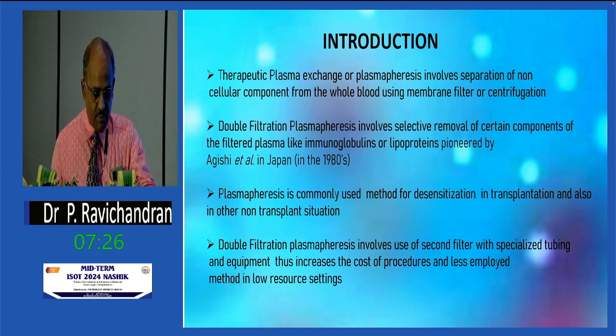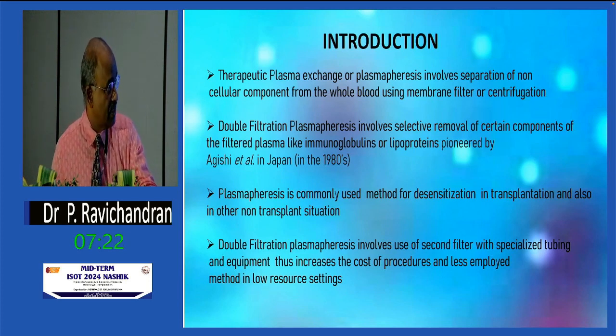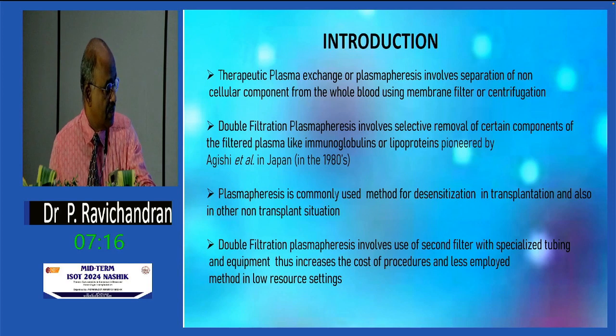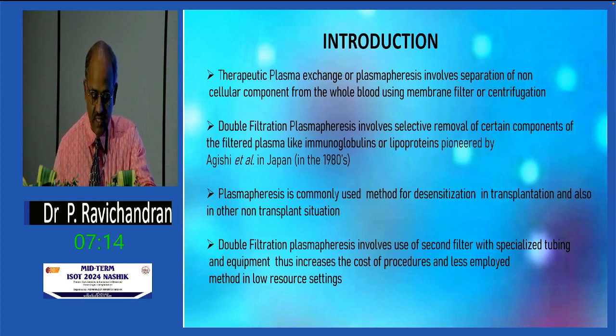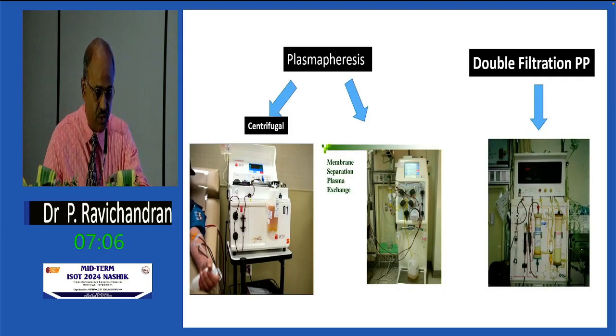Here in India, PLEX is the common procedure used for desensitization in transplant and also in non-transplant conditions. And double filtration plasmapheresis, because it involves a second filter, specialized tubings and equipment, is less employed because of cost, and in low resource settings, it's not widely used.